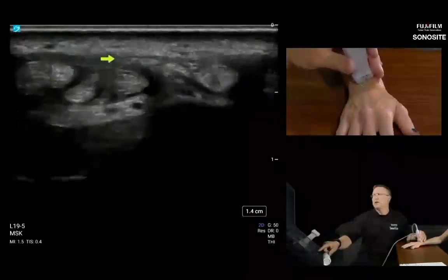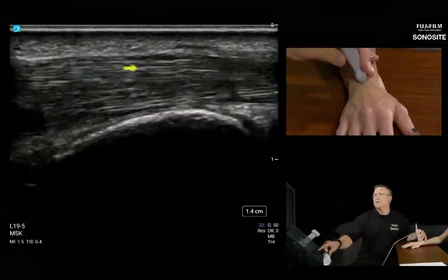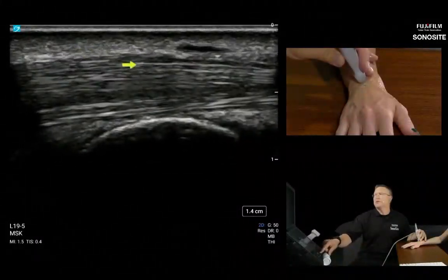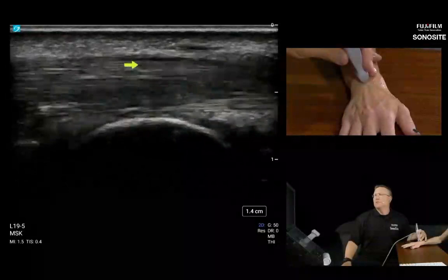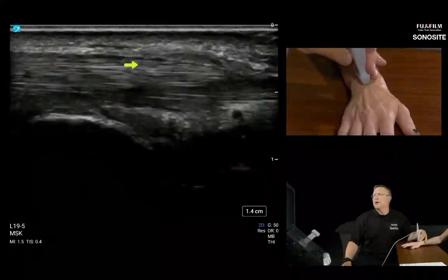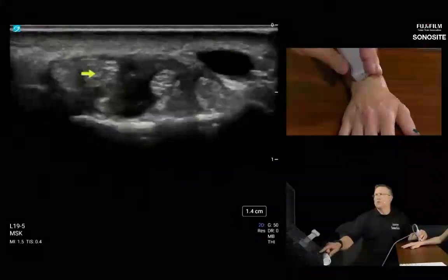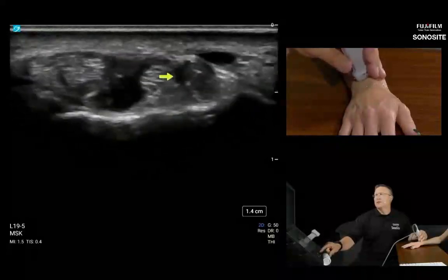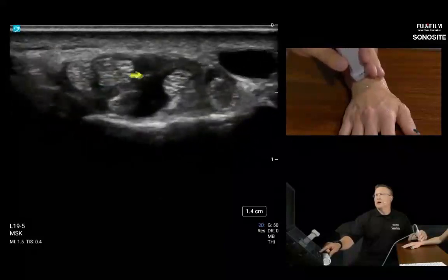Again, we do most of our scanning in short axis, but it's okay to flip over to long axis if we expect any pathology here, and we can see the fibers beautifully. We can see the extensor retinaculum like a big airplane wing superficially. We can flex and straighten those tendons and watch them move and evaluate for any tendinopathy that way. But short axis is really where it's at in detail when it comes to ultrasound. If you can't see these little dots and individual fascicles of tendons, you're dealing with something that's over-processed, and you'll never pick up the subtle tendinopathies that you're looking for.